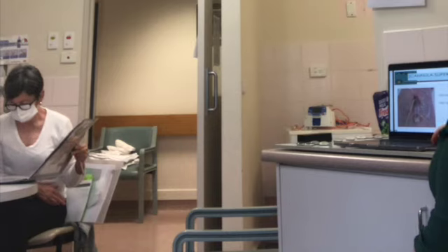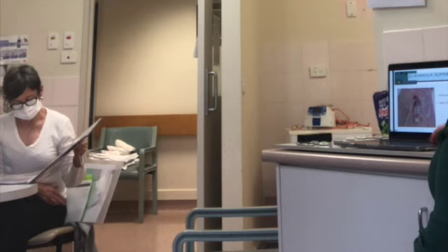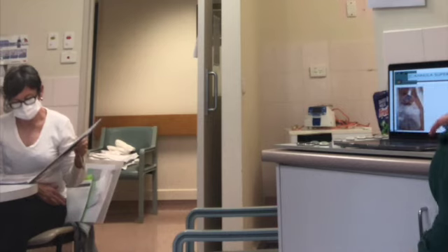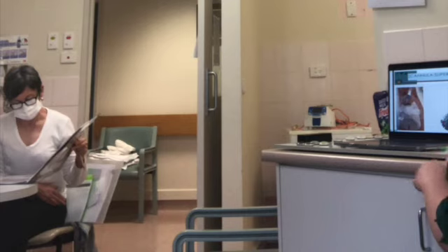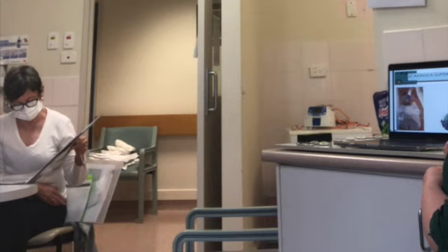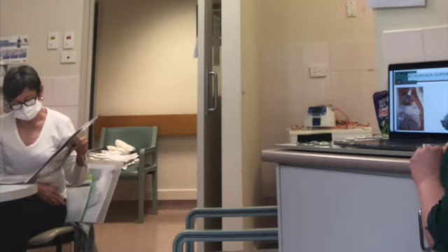If you had that on your own kid in the hospital, would you be happy? And what about this one? This is the worst case scenario I've seen, but you cannot see the insertion site at all. And they've put the dressing on the wrong way. Interestingly, with the dressing, we're going to do a little activity with dressing changes in a minute.